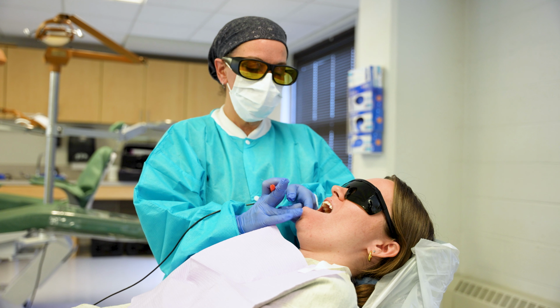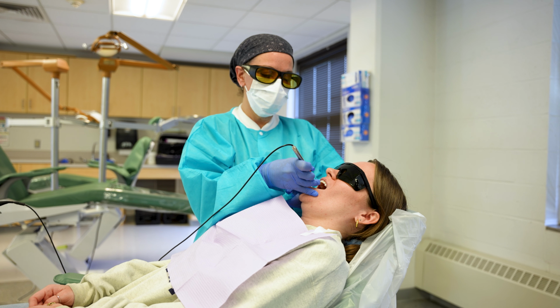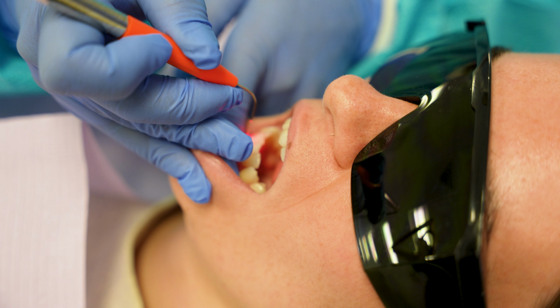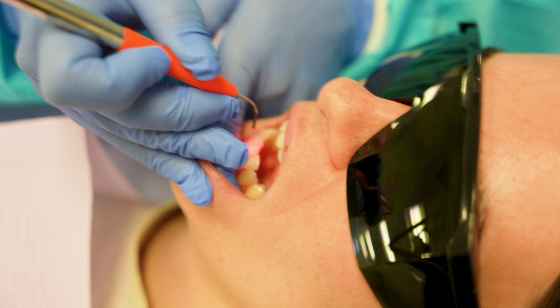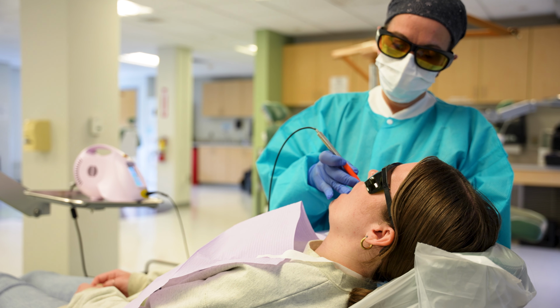It can also do pocket reduction. Pocket is inflammation, and we can reduce the amount of inflammation based on the amount of bacteria that we can eliminate with the laser within the pocket. We can also do that procedure throughout the mouth, and that too will eliminate the amount of bacteria, allowing the patient to heal a little bit better. It's taken the chemical aspect out of medicaments and treating patients. It can kind of seem more of a holistic approach.